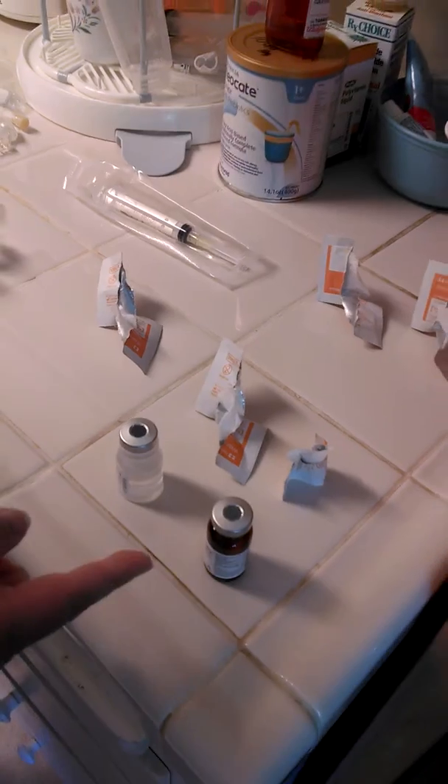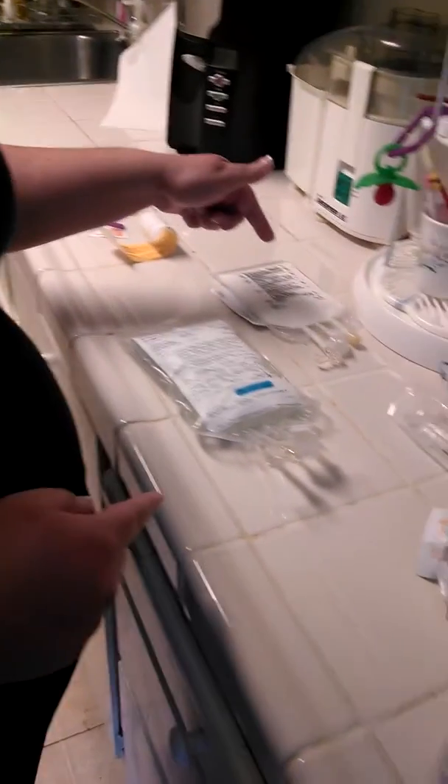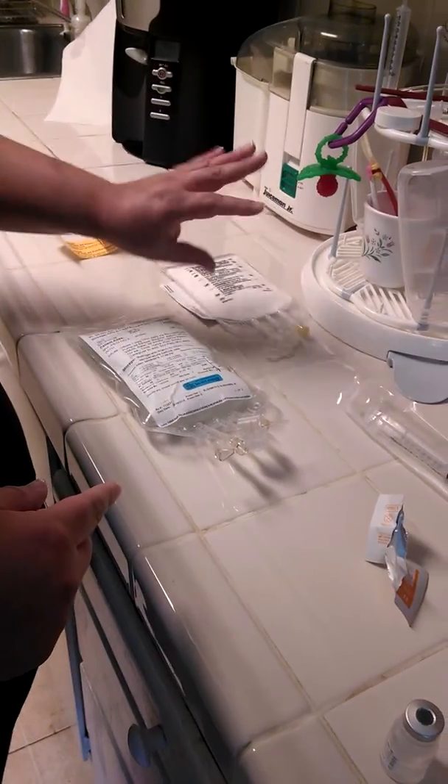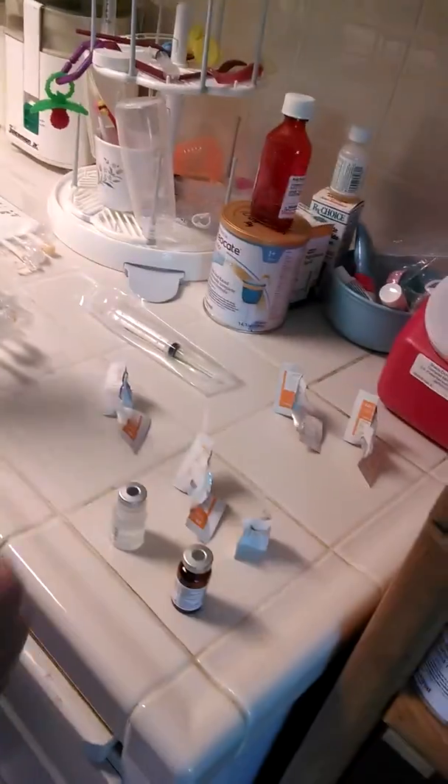I needed five alcohol swabs, sterile water, multivitamin, sterile syringe, TPN, and Omegavin — though nothing gets done with that, it's just hanging out. I flipped my tops open, opened up everything, washed my hands, and now we're going to proceed.